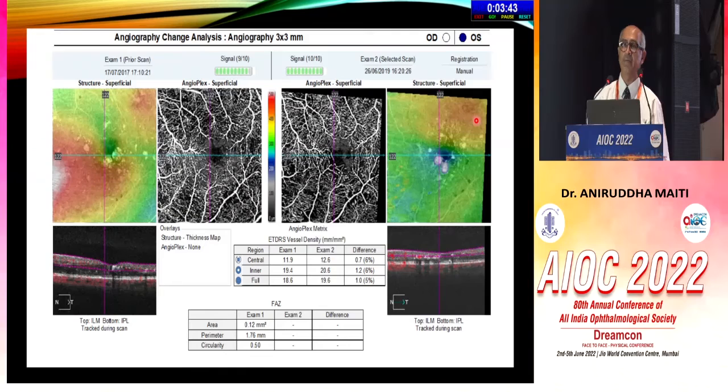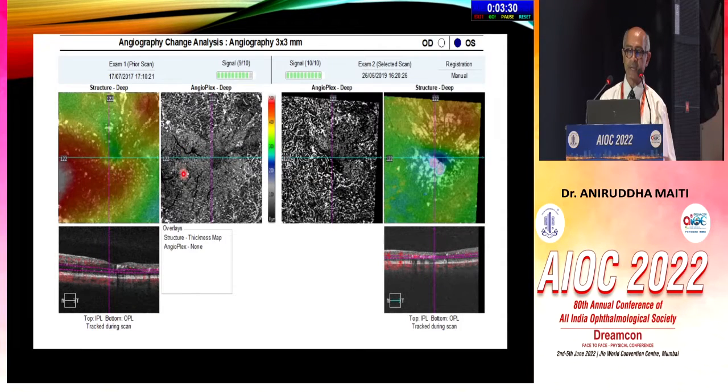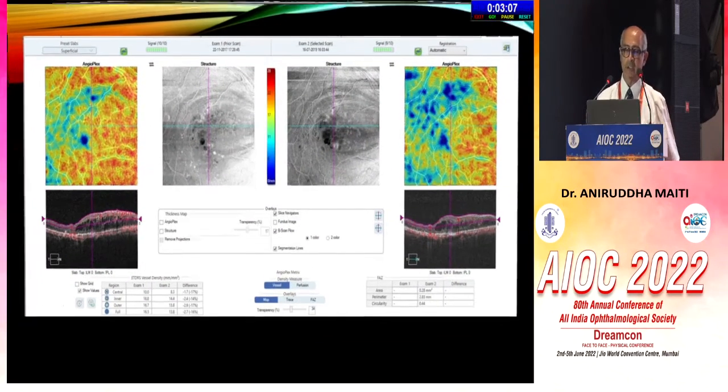Particularly in patients who have this sort of heavy lipid leakage, you can see before and after treatment, the edema has reduced, but the SSPM has also significantly reduced. This is in the superficial layer, and you can see the improvement. All this granular material has gone. It is not granular material, it is some kind of exudate which is throwing shadows because of motion. So this is a situation where that 1%, where not RBCs, but some other material is showing a shadow. And this patient then, of course, has complete resolution of the edema. So this is something which is unique to OCT angiography.